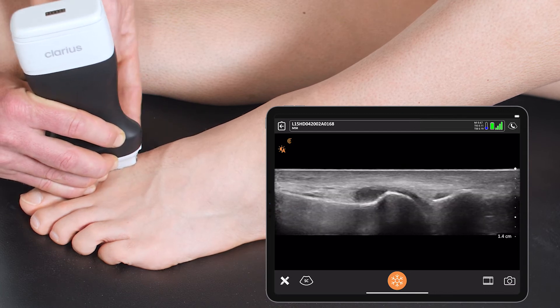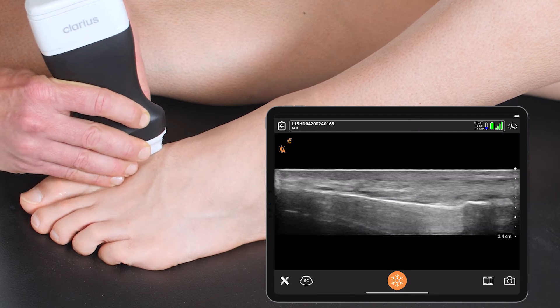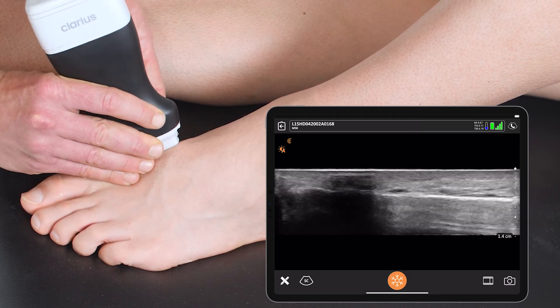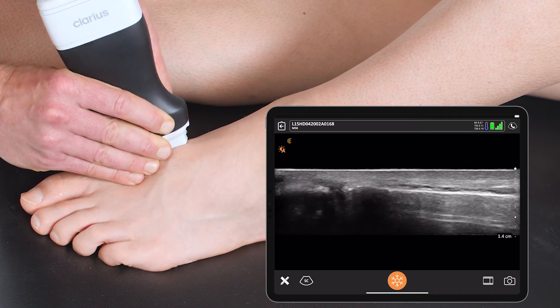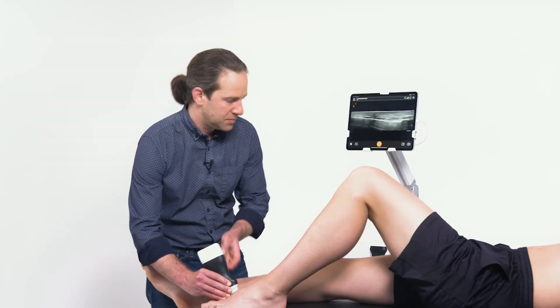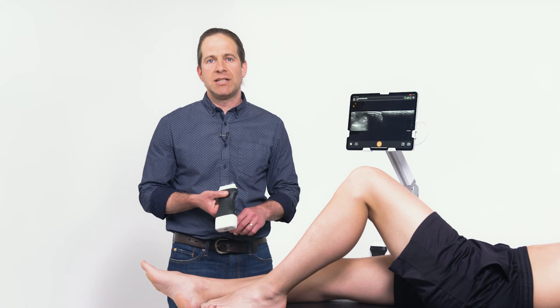I can scan further up the metatarsal all the way to its proximal aspect, keeping the bony cortex in view and looking for any step-offs suggestive of a fracture. But as we see in this healthy patient, no obvious pathology is identified.